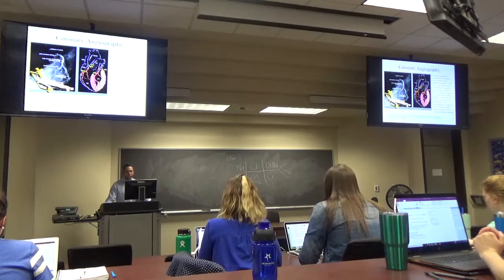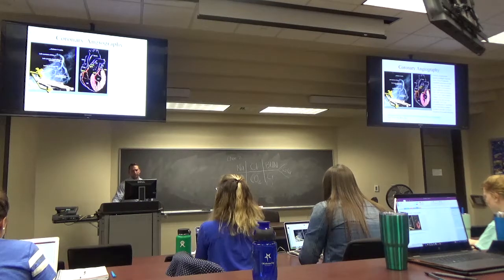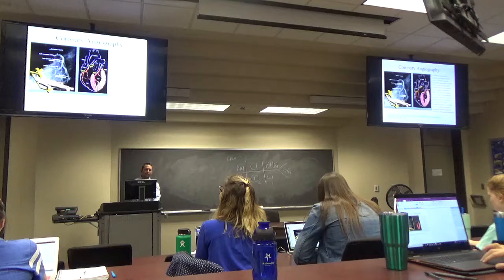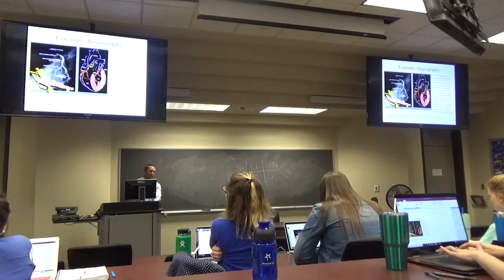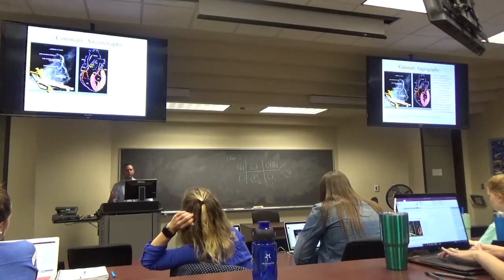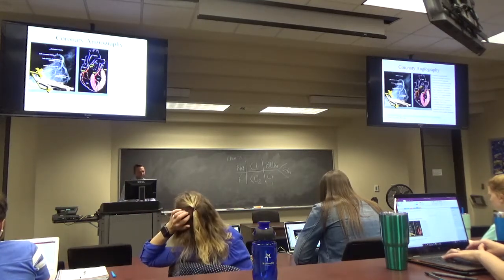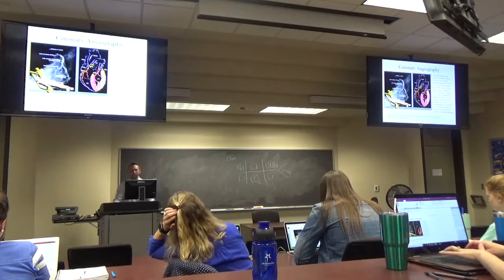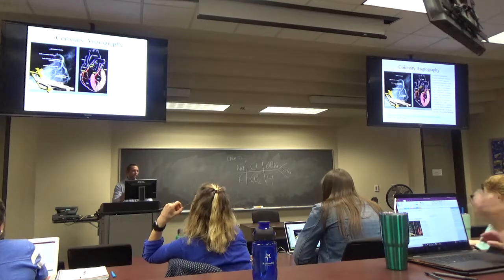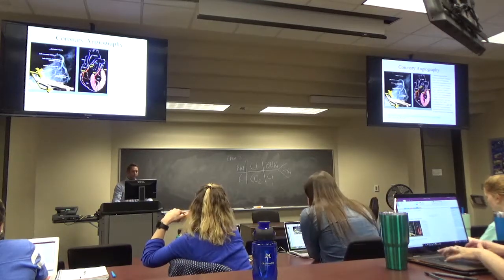All right, so we were talking a little bit about coronary angiography, and it basically requires a bunch of different views. If you look at this picture over here on the left, you have a rotating device that's going around the patient. You're taking different pictures around the patient, all these different views, RAO, LAO. All that means is which side is oblique and which side is down. Right anterior oblique, left anterior oblique. And then you're injecting contrast directly and seeing in real time whether there are stenoses, and then they're performing procedures in real time right after this.